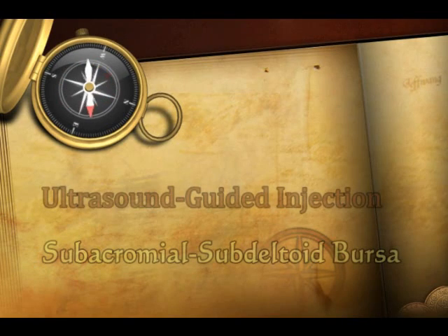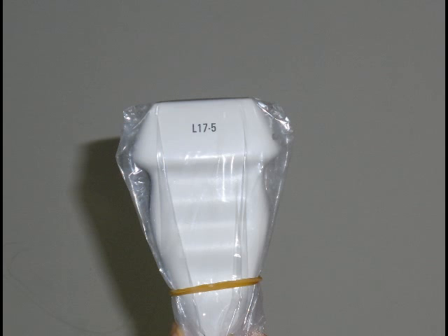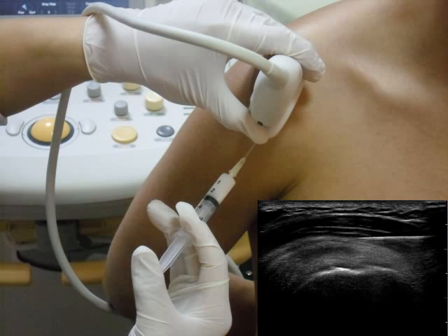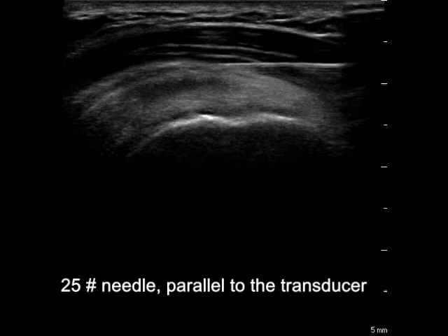Injection is safer and more accurate when it is performed under ultrasound guidance. We are going to demonstrate the ultrasound-guided injection to the subacromial subdeltoid bursa. After careful sterilization of the patient's skin and the transducer, insert the needle in the same plane as the ultrasound beam. The echogenic metallic needle can be visualized under ultrasound. Be careful to place the needle in a parallel plane to the transducer to augment visualization of the needle and make the injection easier. Carefully insert the needle toward the bursa until the needle tip reaches the target.